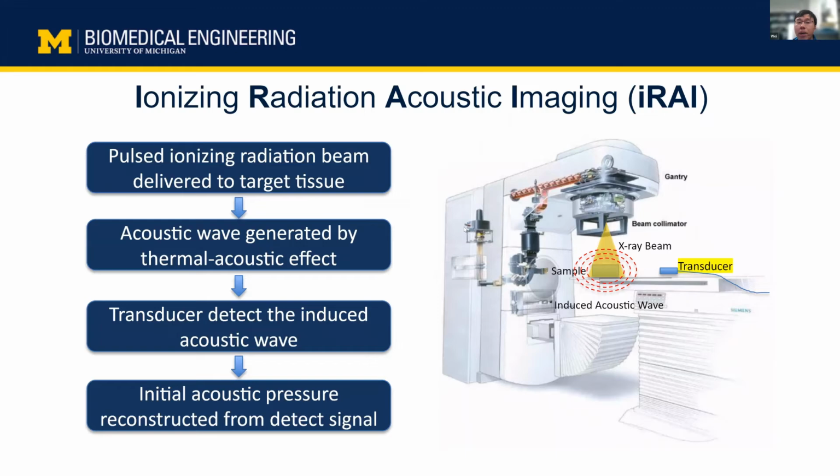So here we are developing a novel technology named ionizing radiation acoustic imaging, iRAI. This technology uses a pulsed ionizing radiation beam, which is directly generated by a clinical linear accelerator and delivered to the target tissue. The acoustic wave will be generated based on the thermoacoustic effect. It's similar to photoacoustic, which is commonly used.